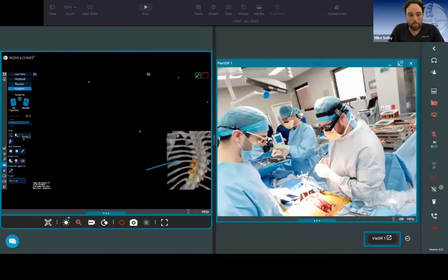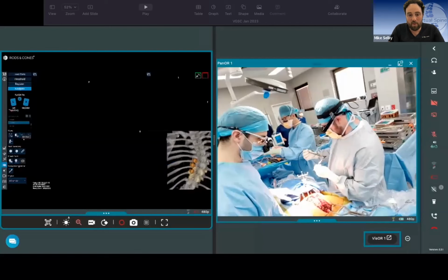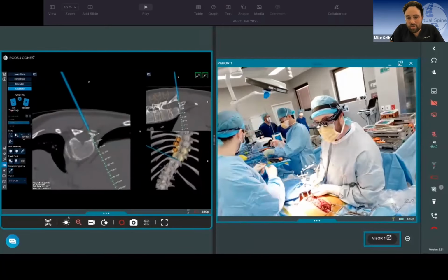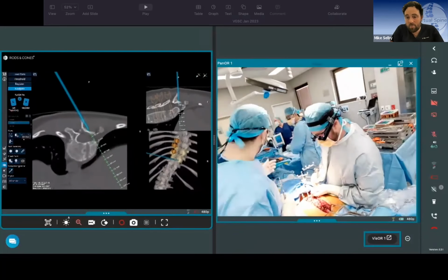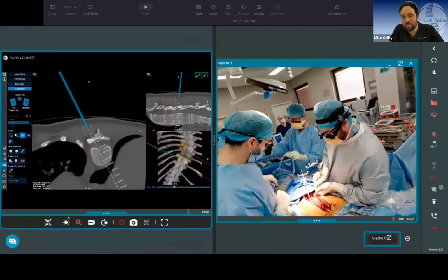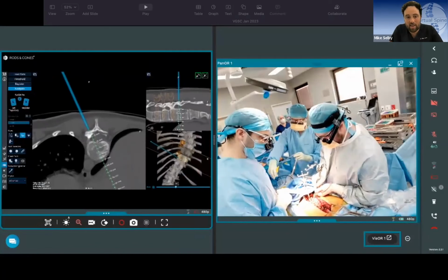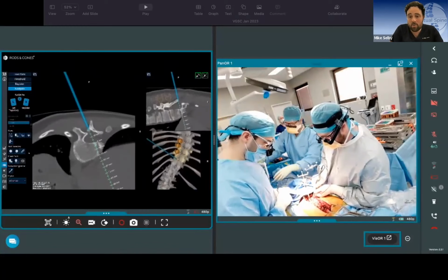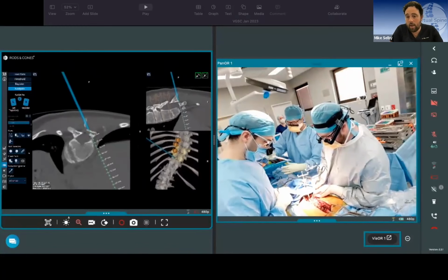And so this is another little video. Actually, this is a super cool part. It speeds me up a lot, right? Because I'm not as adept at working around the dura as my neurosurgical colleagues. I mean, I've done thousands of laminectomies in the past, but I just want these Ponte osteotomies to go really quick. And now I can use the nav burr to basically take down everything to the eggshell of bone and then just come straight across it with a 2.5 or 3 Kerrison.